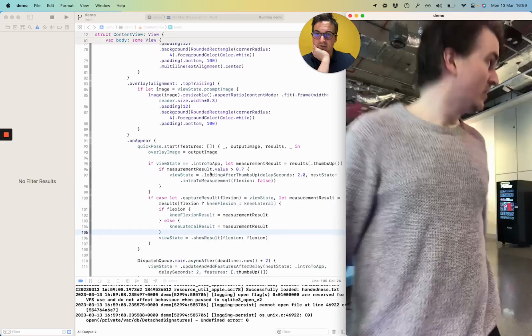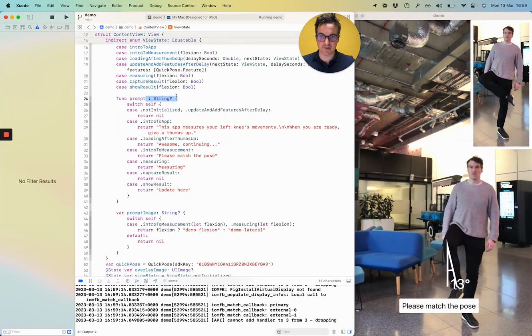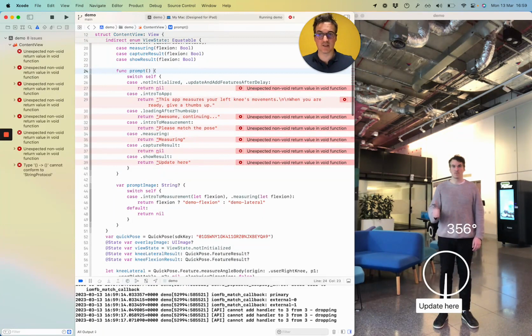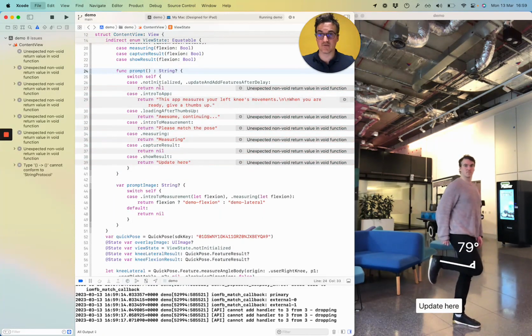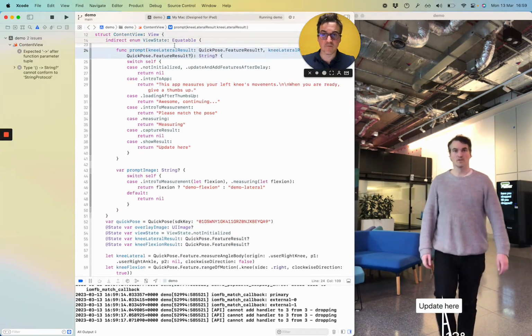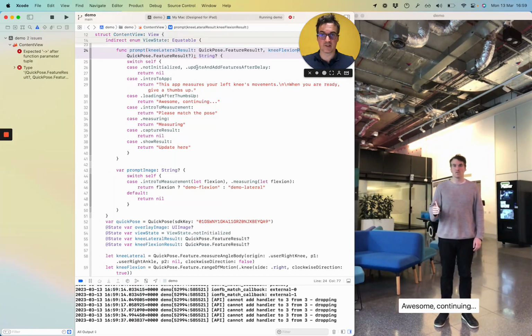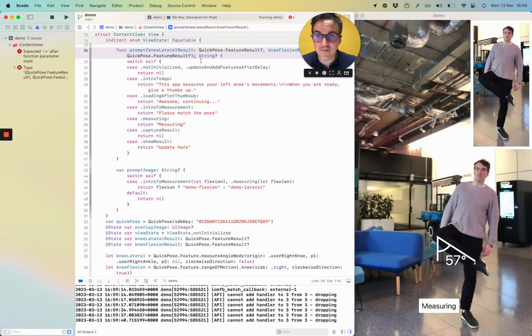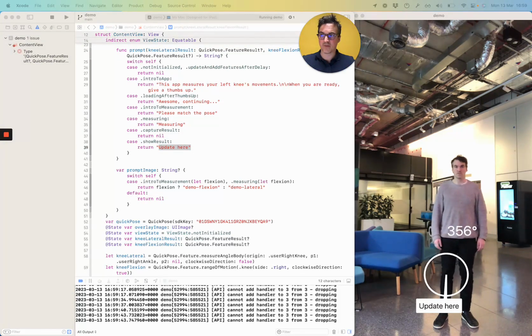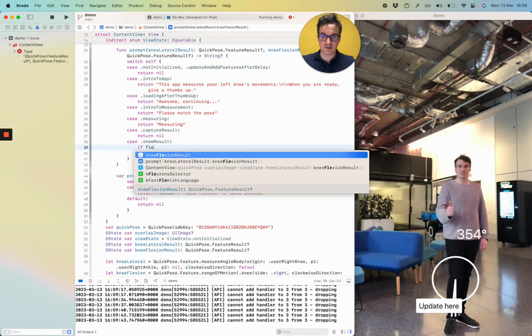We're storing the result though, we're not displaying it. In order to display it, I'm going to have to change this from a computed property to a function so that we can actually pass in the result. Most of these values won't need this, but the optional string return type isn't changed. We want to pass in two separate results, knee lateral and knee flexion. And then in show result, we'll have a split. I'm not entirely sure what that. Oh, a function has that response type. So inside here, I'm just going to do an if flexion split.